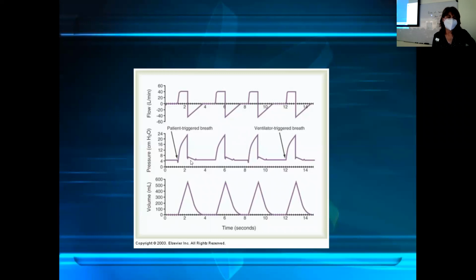All right, so with the pressure time graphic, where does exhalation begin? Does it begin here? Does it begin here? Yes. So maximum pressure builds, and then when the exhalation valve opens, the pressure leaves the lungs and this line comes back down.